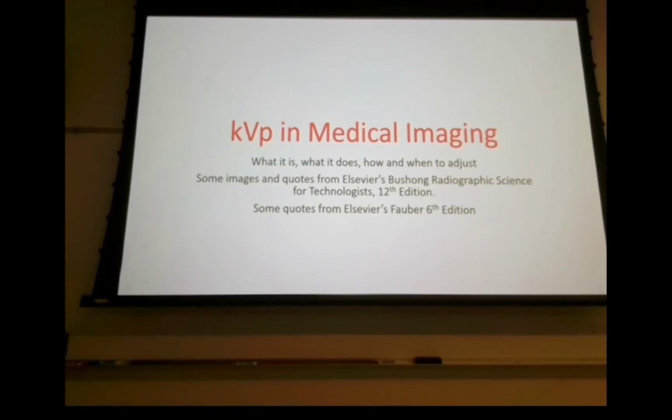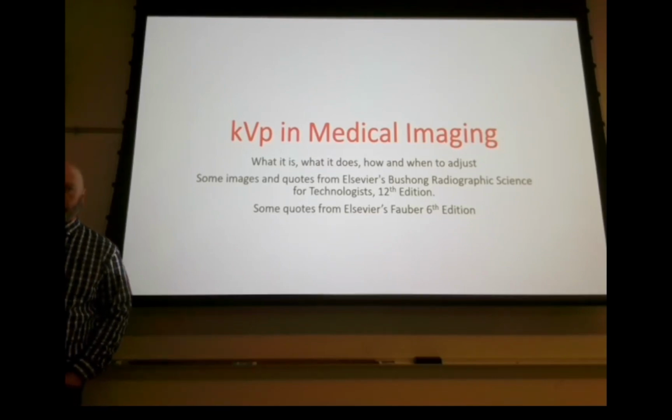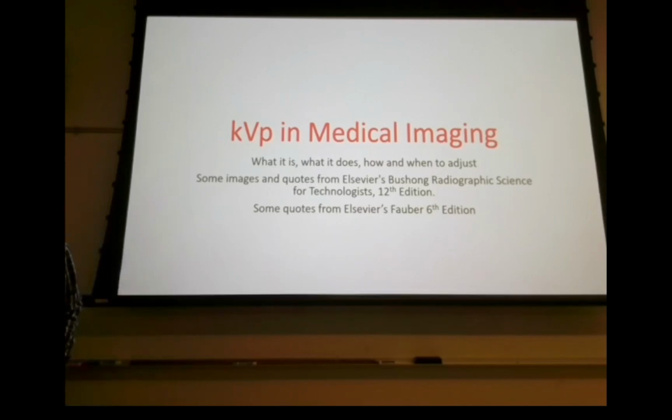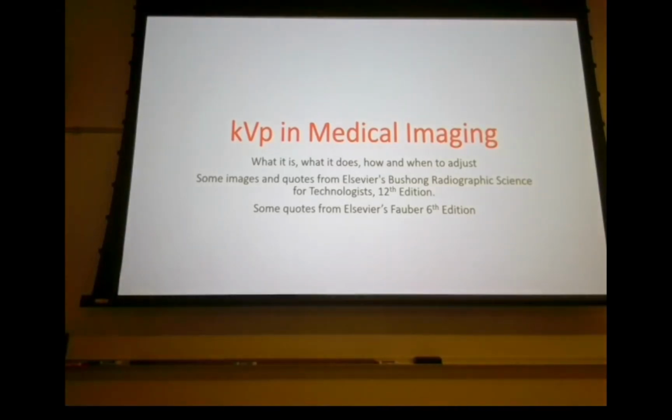So just as a preface to that, we've got a lot of things that we've got to consider in the X-ray beam. We've got an X-ray beam inside of the X-ray tube. We have an X-ray beam emitted from the X-ray tube before it interacts with the patient. We have interactions in the patient, and then we have remnant beam and what's going on with the remnant beam. And I think that's where the confusion is with the scatter versus interaction.